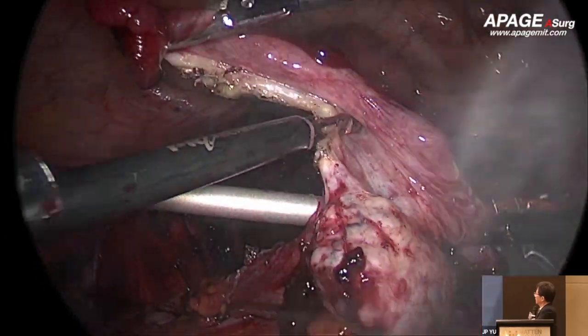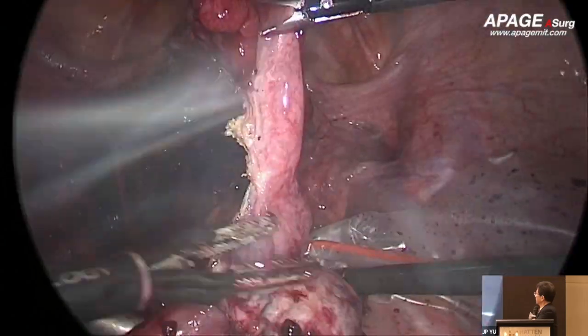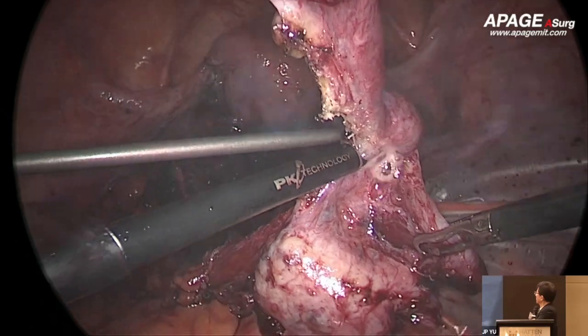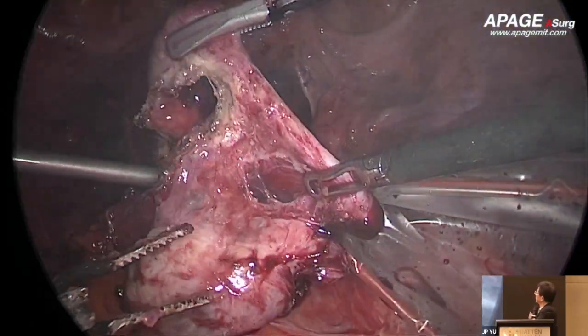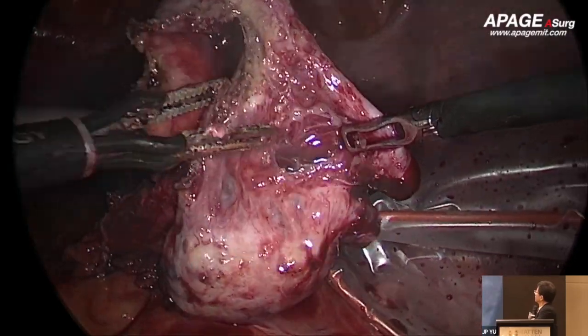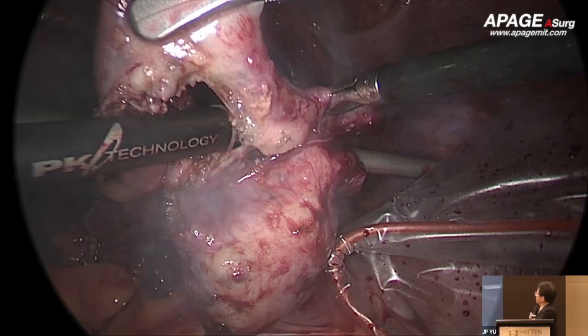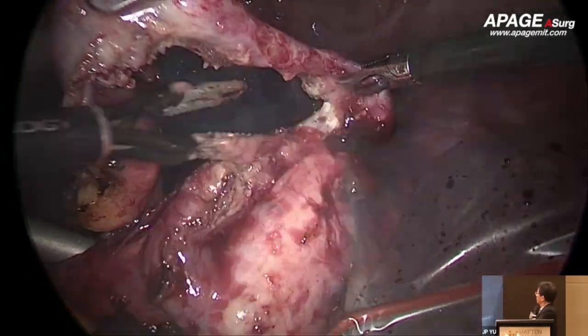So we put it in the bag and remove it on the right and left side. Okay, we can find they always have so many obvious endometriosis lesions on the round ligaments and also the posterior wall of the uterus, and then we resect the fallopian tube away.